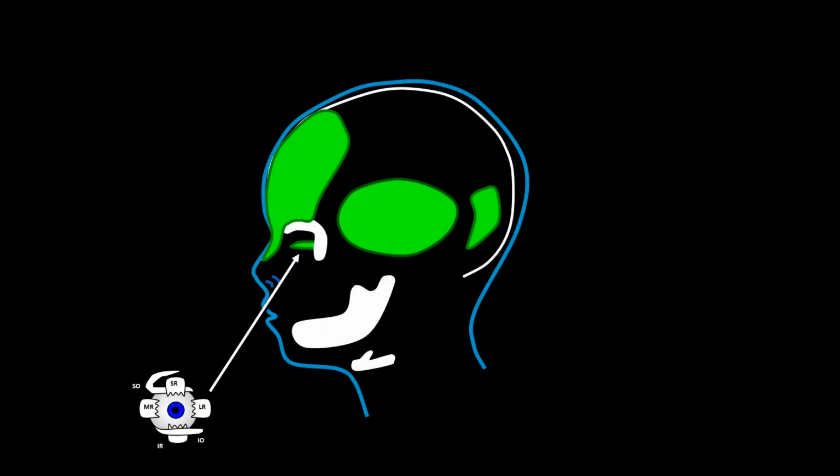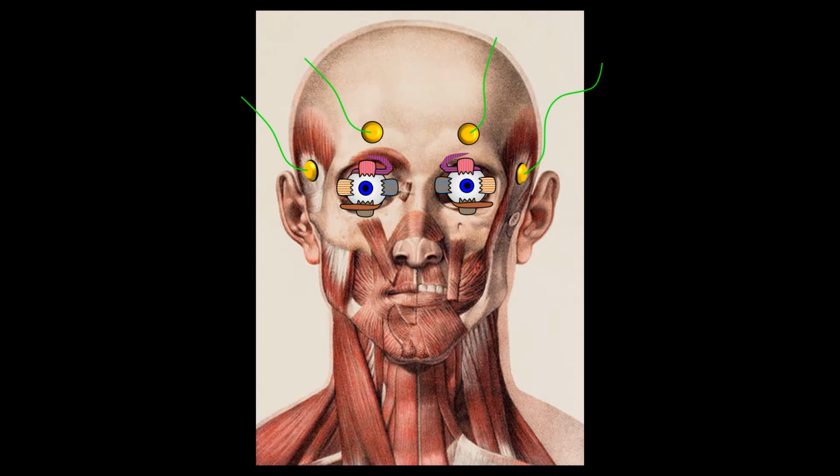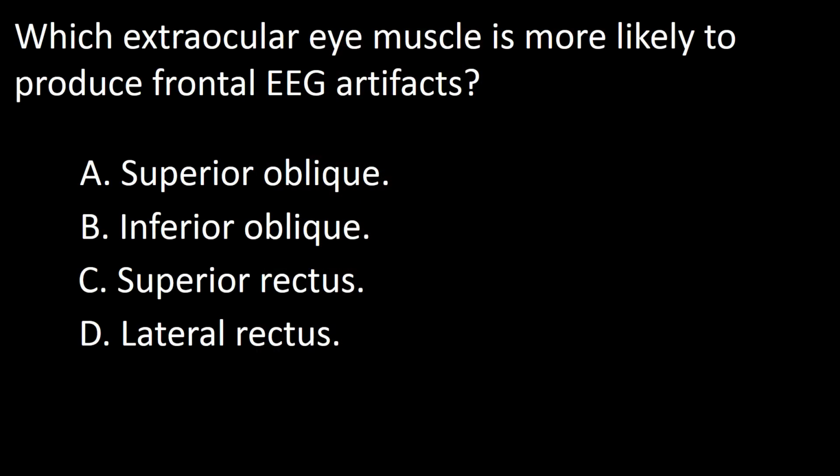In this frame, I'm representing them in a cartoon to show you the position of the lateral rectus in relation to other muscles. I have represented the proximity of the electrode to the lateral rectus in this frame. So the answer to this question is D.